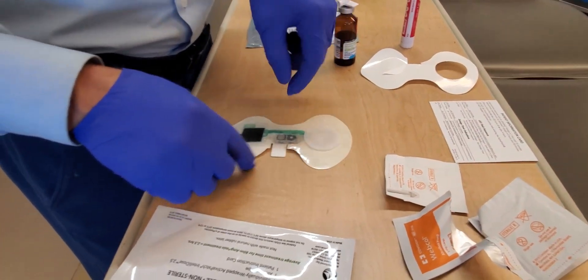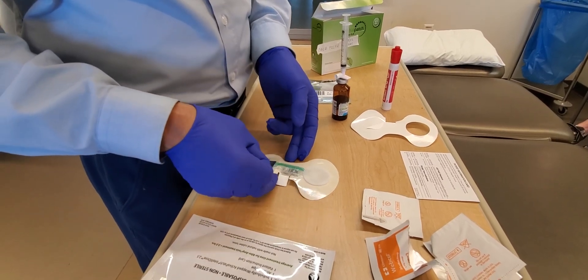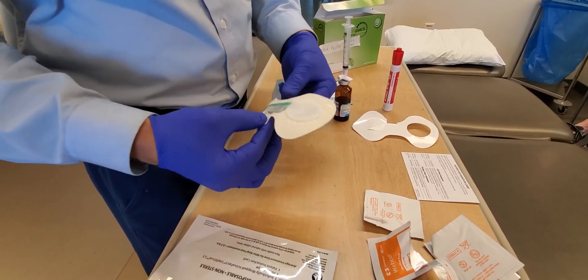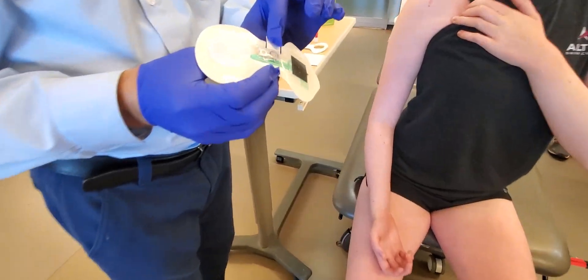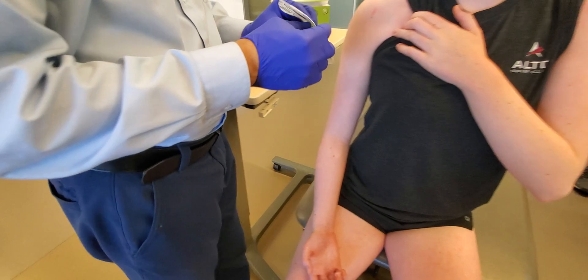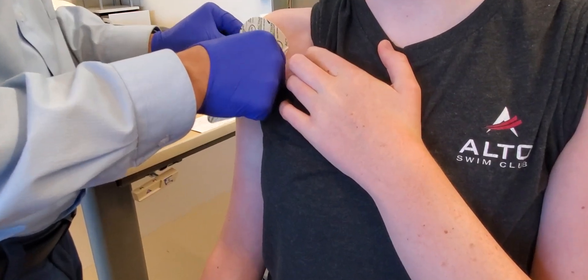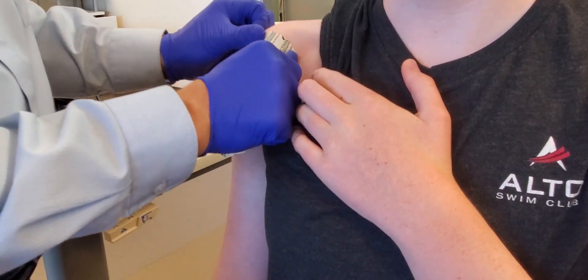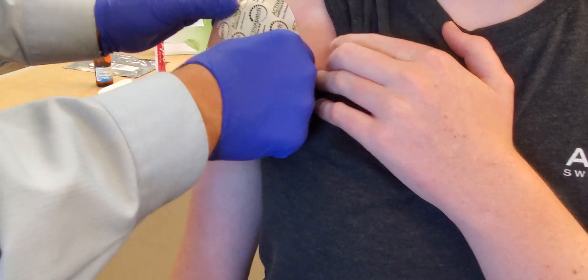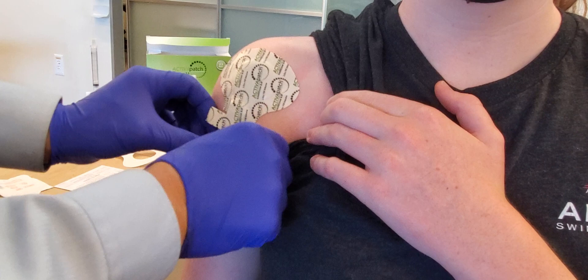When placing it on our epicenter of discomfort or pain — in this case the proximal biceps tendon — the lower portion goes down the arm. It can be quite sticky with gloves, so the key is to keep that last little bit of adhesive covered. We're going to come in, making sure that our pad is directly over the marker.